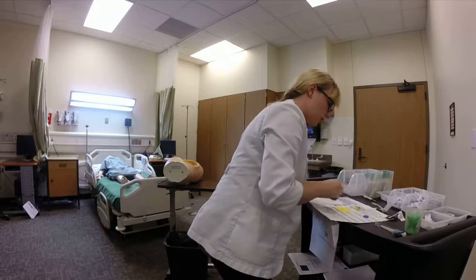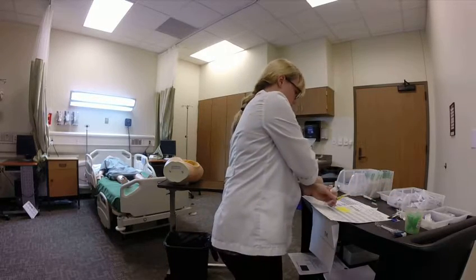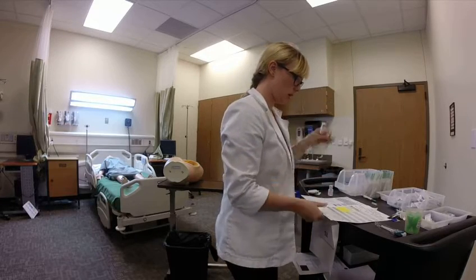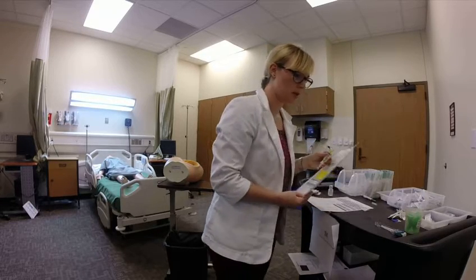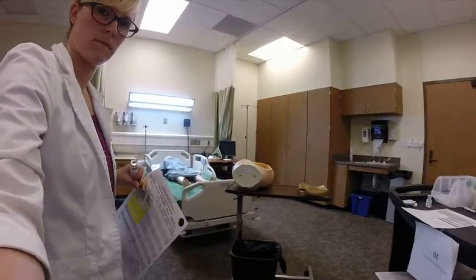I've got everything I need. I'm going to file my medication and my alcohol pad, and go into the room.